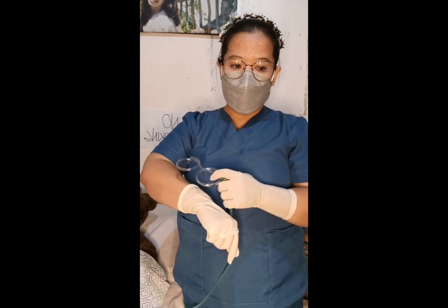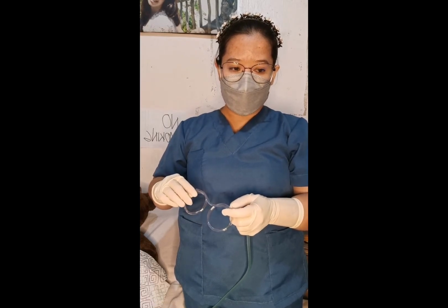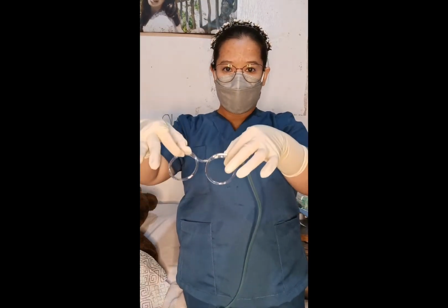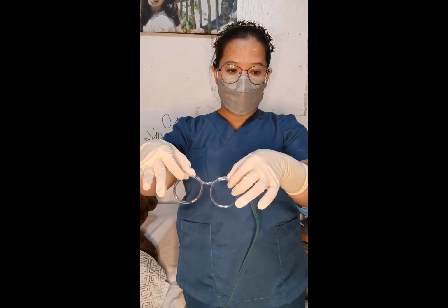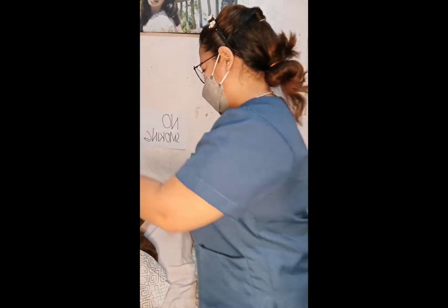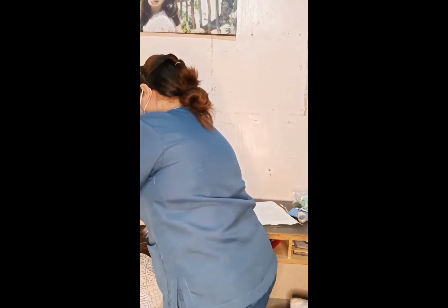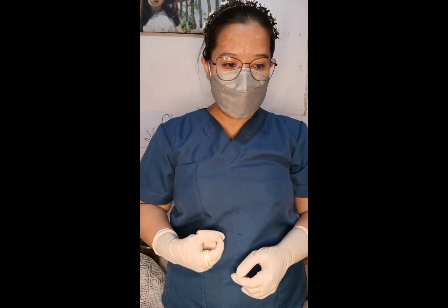and then we will hold the nasal cannula in a proper position with prongs curving downward. So we will hold it this way, and then place the tubing over and behind the ears. We can place a gauze at the ear beneath the tubing as necessary. This is for the proper placement in the nares, to ensure accurate administration.